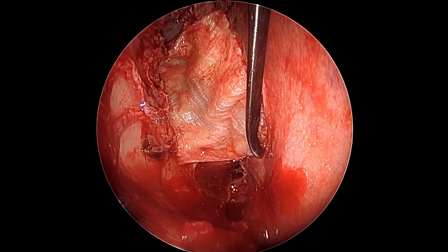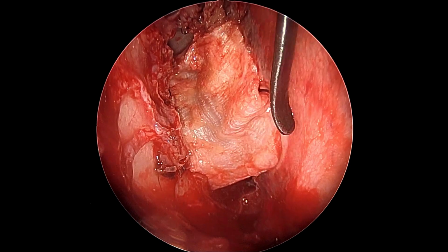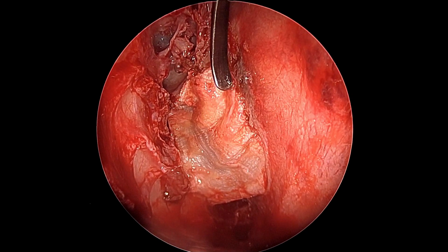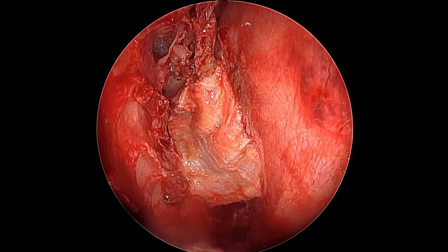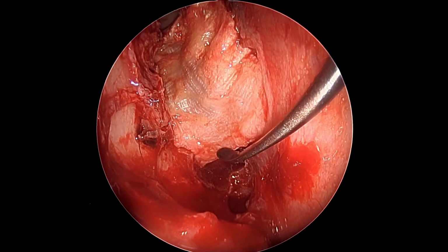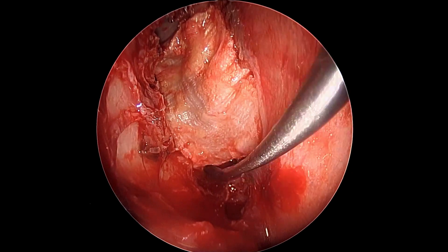So this fascia graft, as you see, is being placed. Sometimes even this could be slightly larger than usual. We have just placed it with approximation. You can also make actual measurements using a suture sheet, the suture cover, to make approximate measurements to see how big it is. If it is too big, it is obviously difficult to place, and it won't be taken up. If it is too small, again it defeats the purpose.